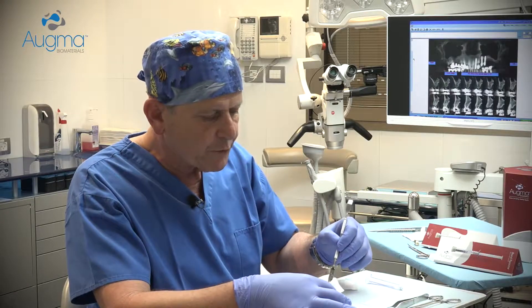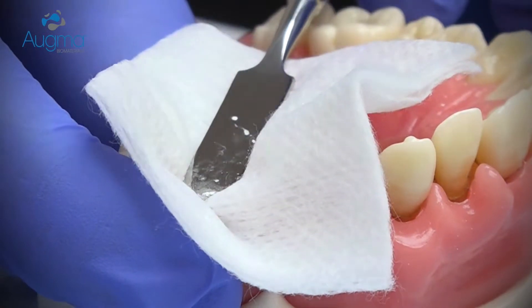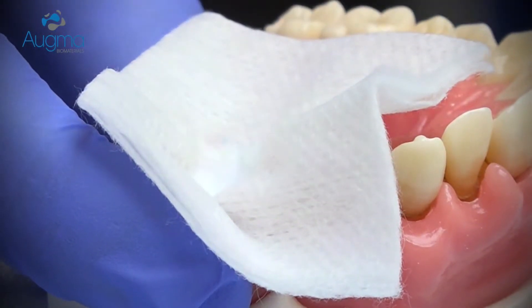Now take a dry gauze and press firmly the material into the socket. If there is not enough place for your finger between the teeth, use a spatula or an elevator and press above the dry gauze.